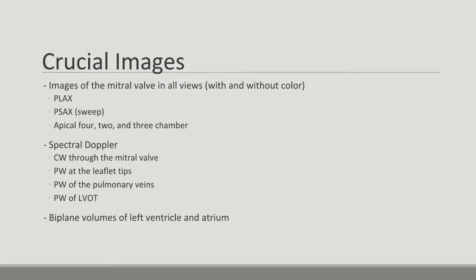Finally, biplane volumes of the left ventricle and atrium are important to see the remodeling effect that MR may have caused. Be aware of the ejection fraction, though, as a normal LVEF for patients with significant MR is higher than normal, around 60%.